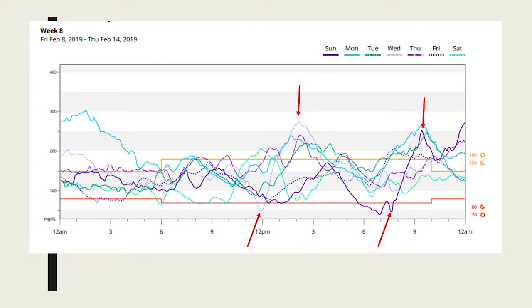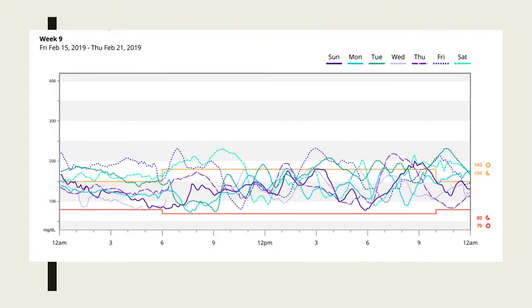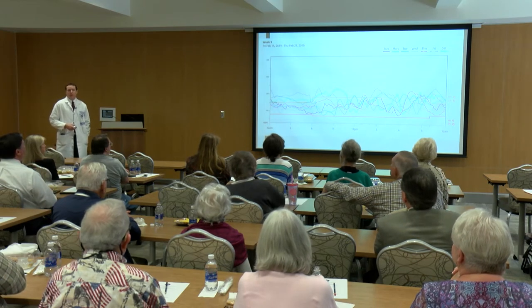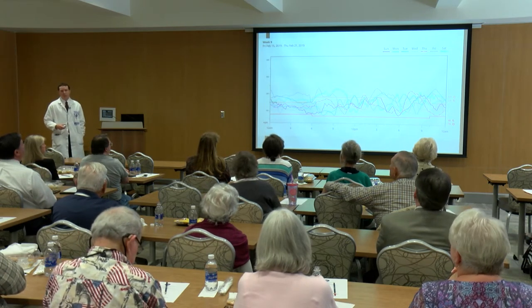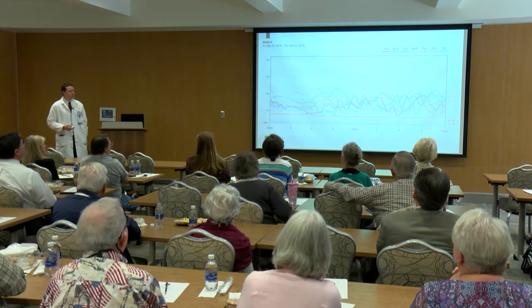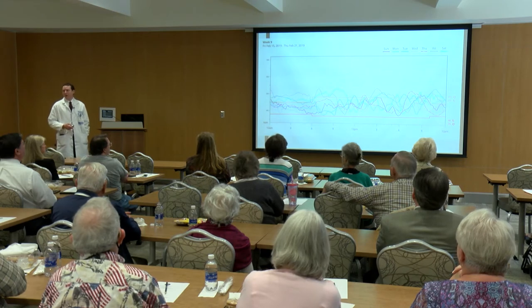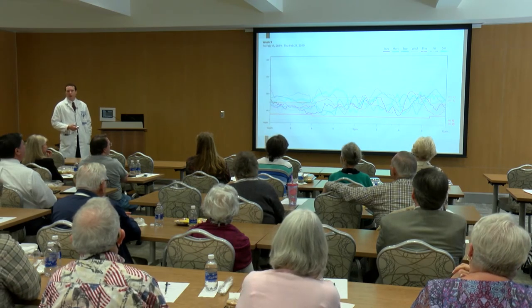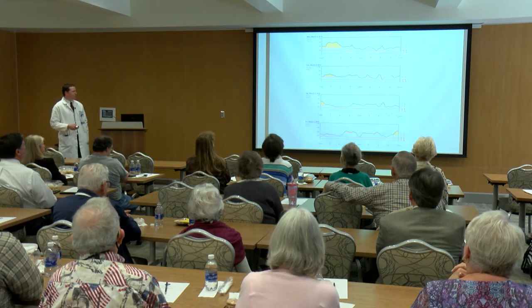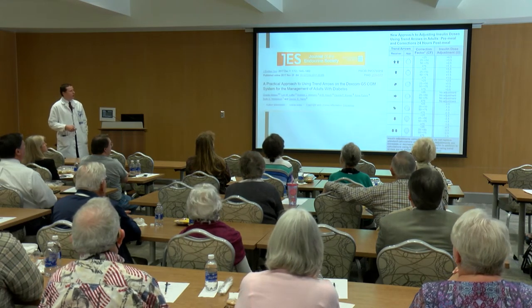They provide us with a tremendous amount of information. Knowing what to do with that information can be a little bit more difficult because of the variability. I mean, this is a really good week. Look at the difference between these 2 weeks. If you had to make adjustments in insulin based on just these 2 weeks with the exact same settings and profiles, you might make entirely different adjustments. And so we need to understand the variability in the glucose values in these disease states. Now this is just some different tracings.